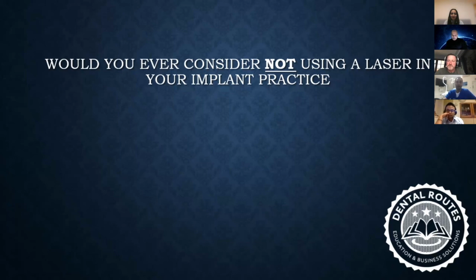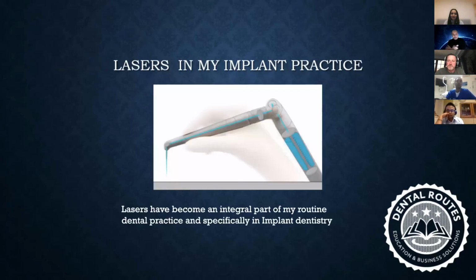Lasers have become, Koushik, next slide, please. Yeah. Lasers have become an integral part of my routine dental practice, and more so in implant dentistry, which is my area of special interest. As Koushik was saying, even when there is no need for removal of granulation tissue, or if I don't use it on soft tissue incisions, at the end of the osteotomy site, I will use my laser so that the energy is absorbed into the tissue, both the bone and the soft tissue, so that absorbed energy results in better healing, better osseointegration.